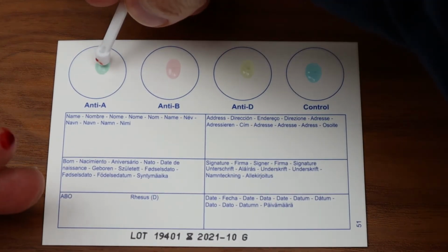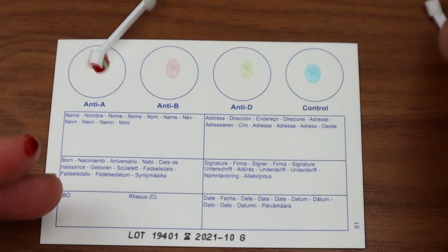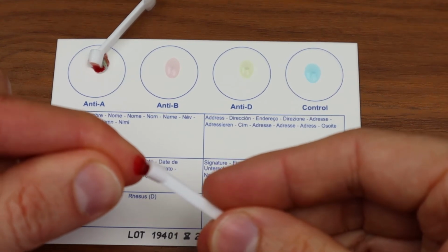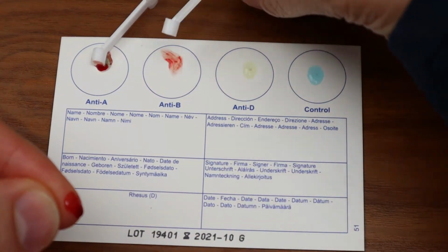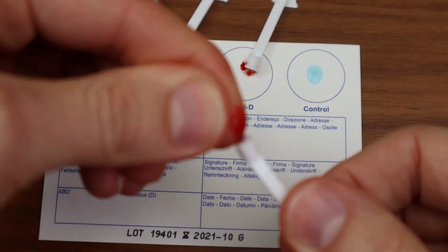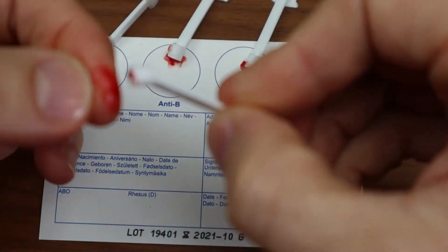Then transfer that blood to the first circle containing the water drop. Let the blood come into contact with the water and just lie the stick down for now. We're going to repeat this 3 more times using a new Eldon stick each time. Now stir each one with its respective stick and be very careful not to mix adjacent circles.